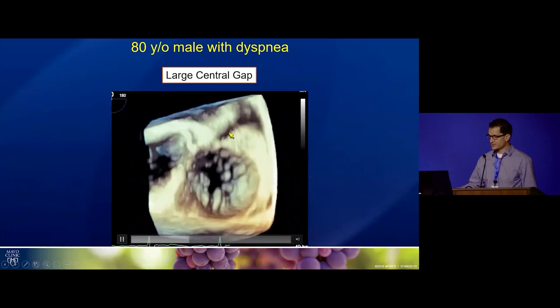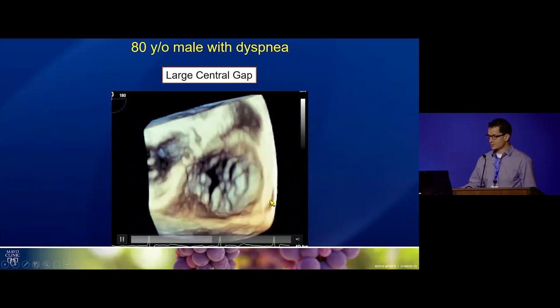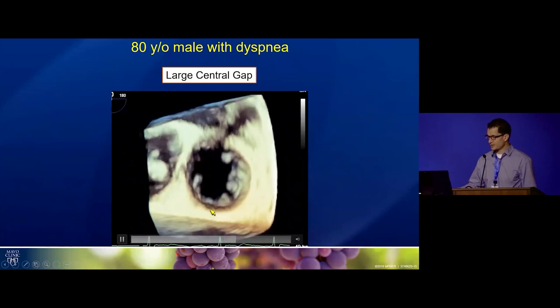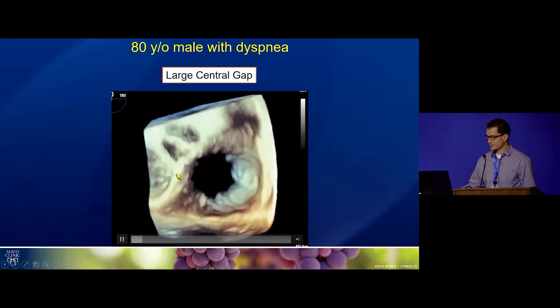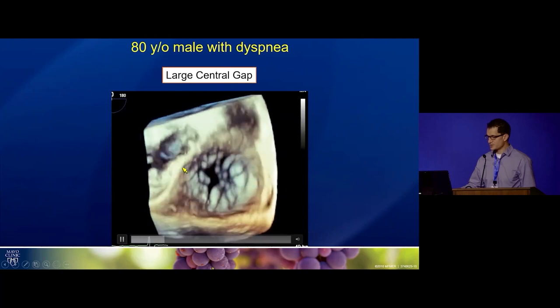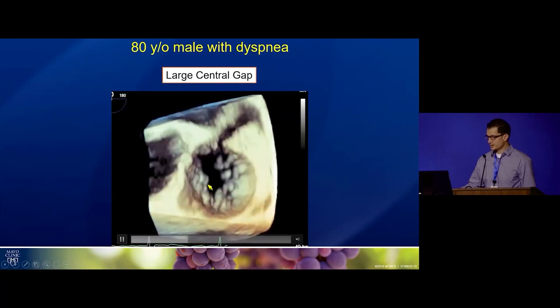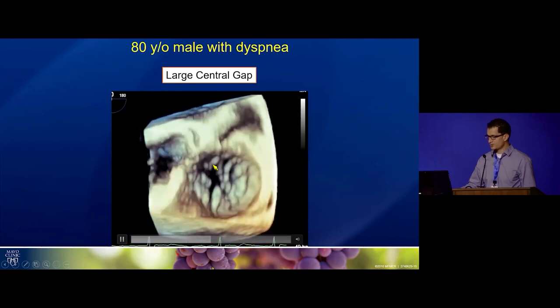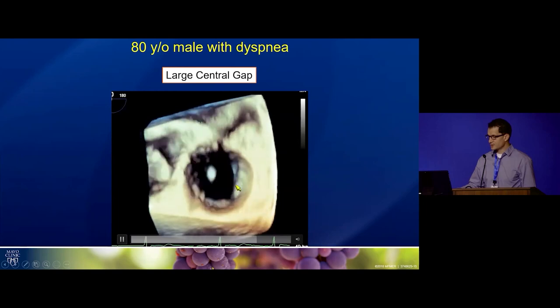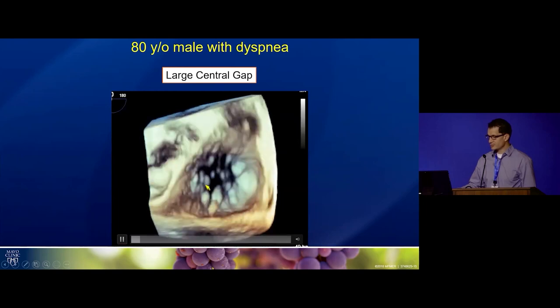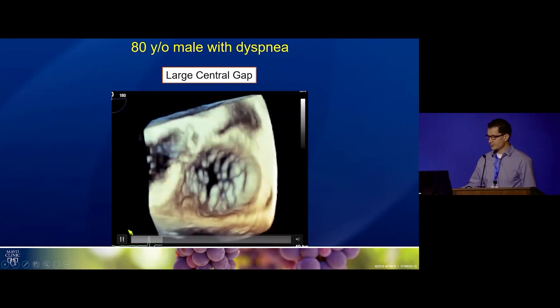3D imaging shows the very large septolateral gap and this broad jet of TR. For reference, this is the tricuspid valve from the right atrial perspective — the atrial septum, the septal leaflet, the big anterior leaflet, and the posterior leaflet.